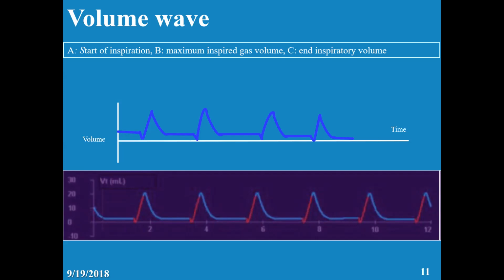Yes, Doctor. Okay, now looking at this volume, what is the control that you think is here? Is it pressure control or volume control, and why?